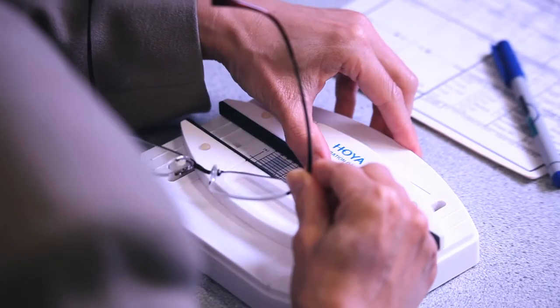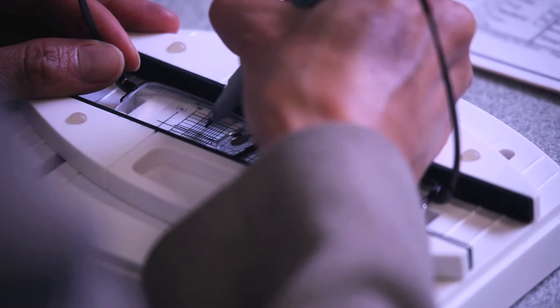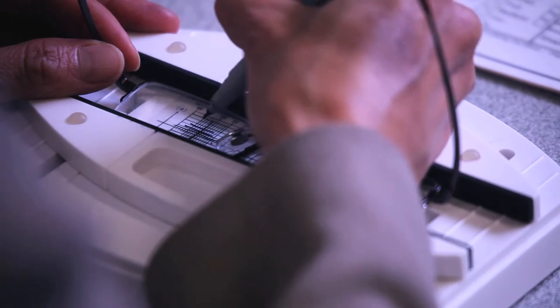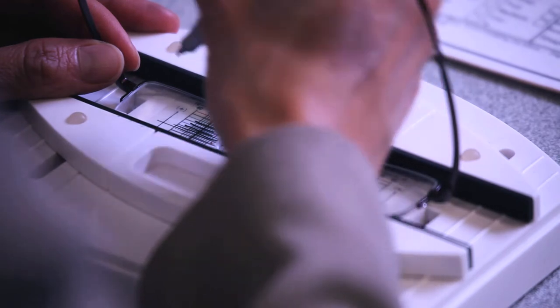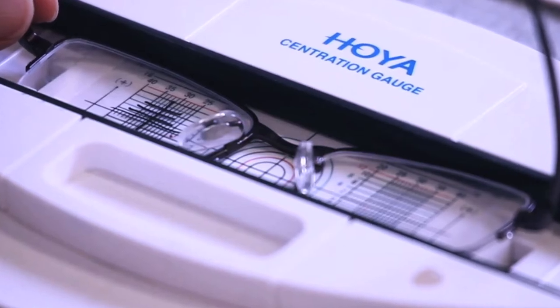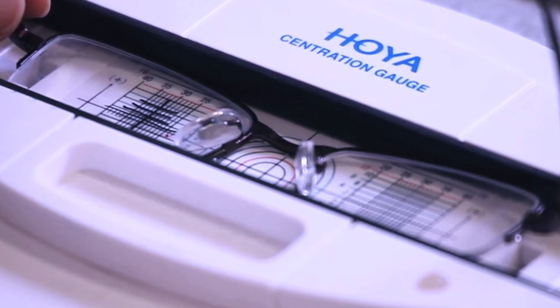The first alternative for step three is to draw your own graticule on the inserts with the help of a parallel rule. This method is sometimes called pre-marking. Mark the horizontal center line on the lens inserts of the frame and draw a vertical line at the monocular PDs, marking off each two millimetre above and below datum with a fine tipped pen.